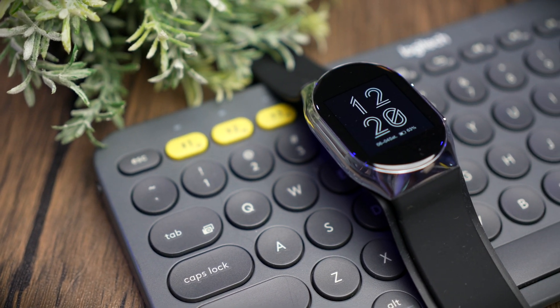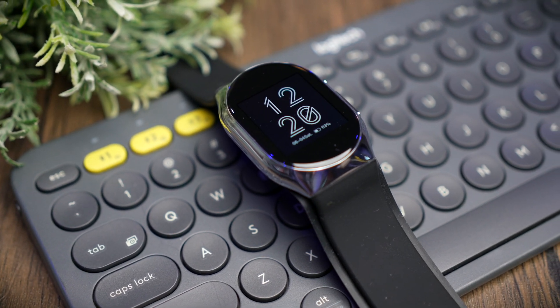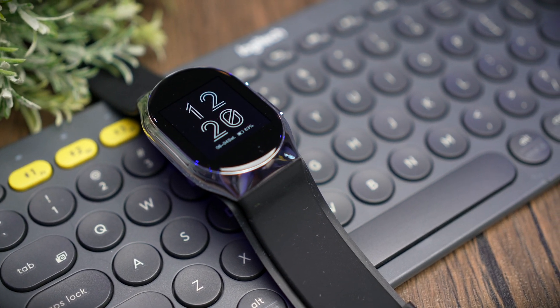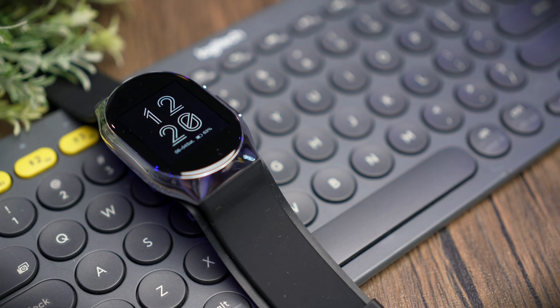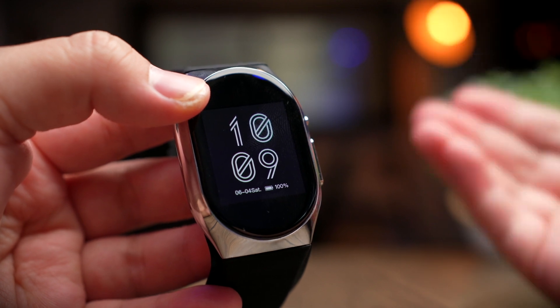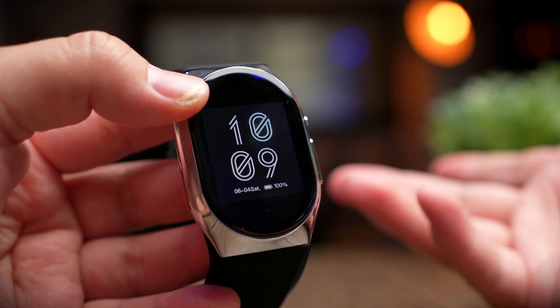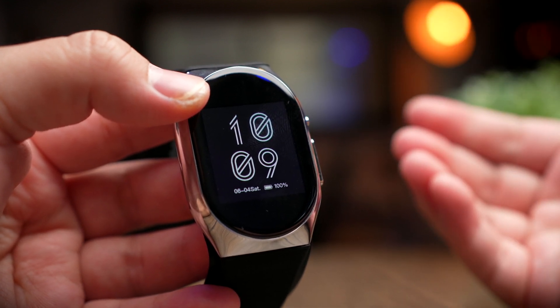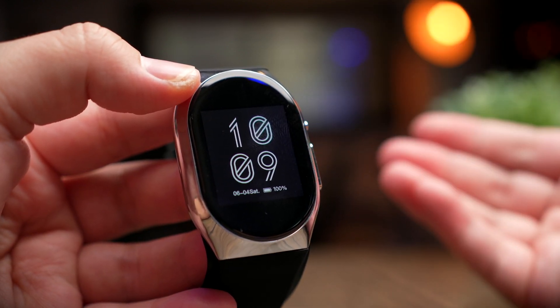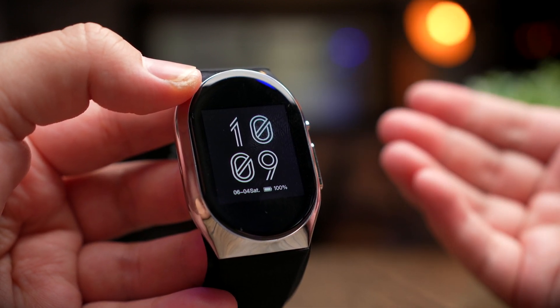Another thing to point out is the always-on display feature. With it enabled, your battery literally disappears in a few hours — especially combined with BP tracking and constant heart rate monitoring. I hope future updates add a dimming or power-saving mode like most watches today. On the upside, charging is fairly quick at only one hour, but asking parents to wear a medical device that needs daily or frequent charging would be a big no-no for them.